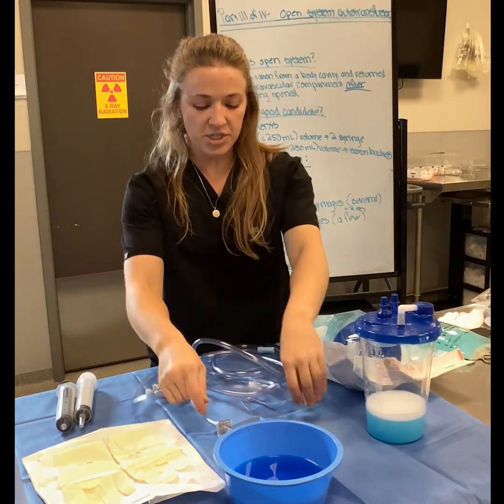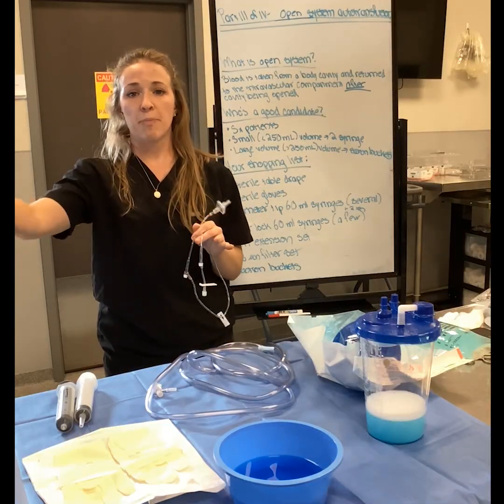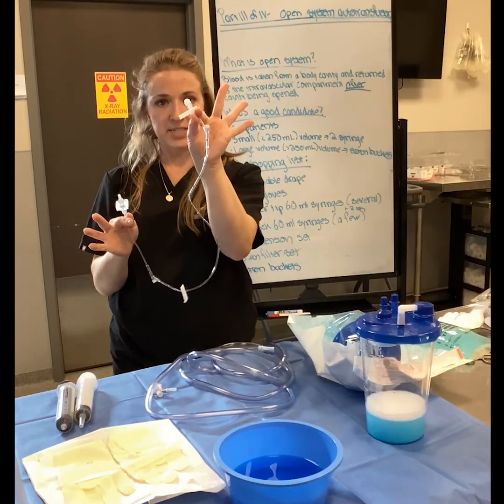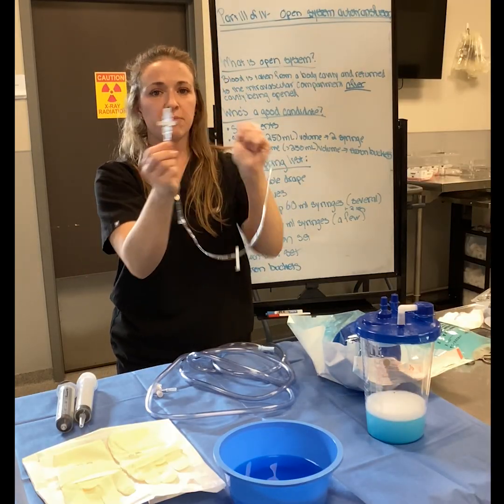A fluid extension set. If you are doing the 2-syringe technique, you're going to take it from the belly to the catheter tip to the luer lock. And then the luer lock gets attached here and the blood goes through the extension set and an 18 micron filter.